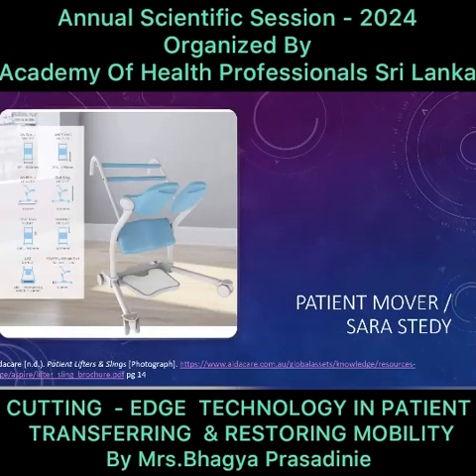Okay, so next we are moving to the SARA stedy. The SARA stedy or the patient mover is again a manual one. The machines or equipment we have discussed so far are all powered ones or electrical ones. So the SARA stedy is a manual one, and it operates through leverage.